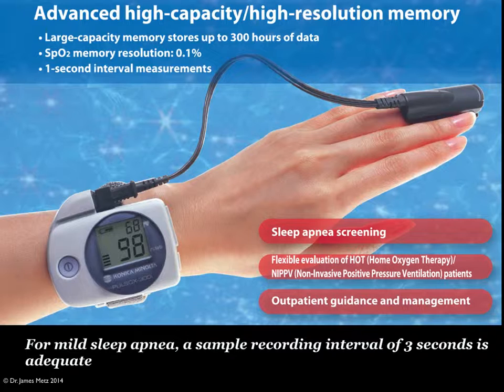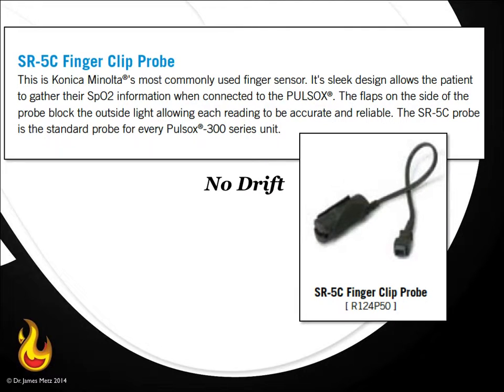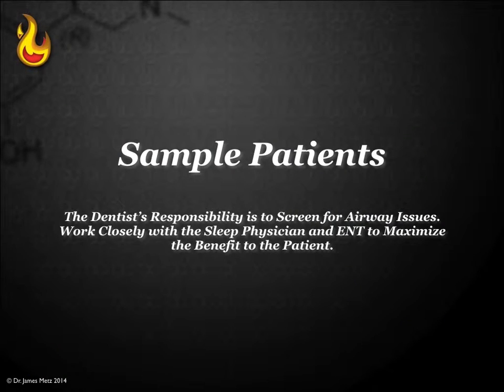This is the one from Minolta. This is one of their ads, and it's just what they show. This is the finger probe that I like the best. There are several different probes, and this one has been a little bit of a problem. Sometimes it'll make a person's finger sore overnight, but they can just move it from one finger to another. They don't need to leave it on that finger. You'll see the error, and you'll have no trouble knowing what's what. Here are some sample patients.